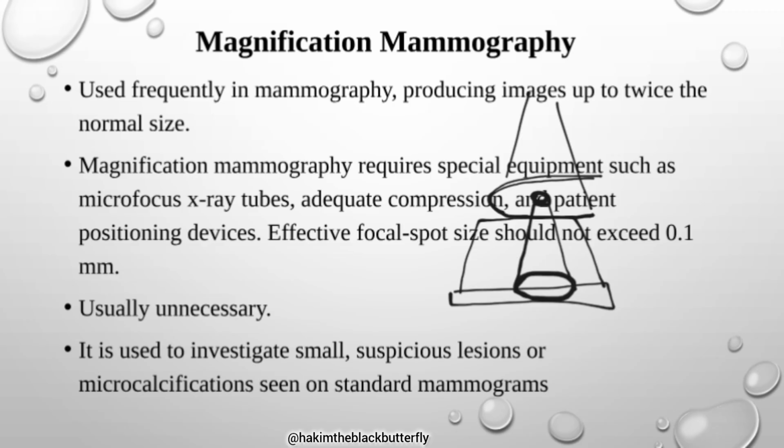If all the imaging techniques are followed, is there no chance for artifacts that could lead to misdiagnosis? Yeah, if you follow everything to the dot, as I've said, there won't be any artifact in the final image of mammography. And mammography really has very few artifacts, unless there is a problem with the image receptor itself. But if you follow to the dot, you won't create any artifact in the final image.